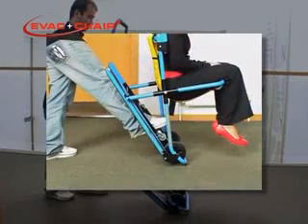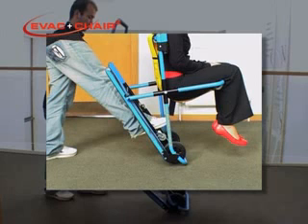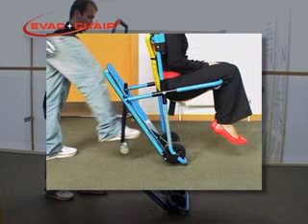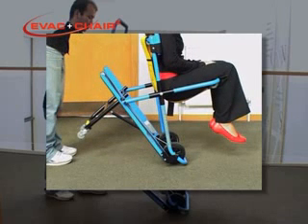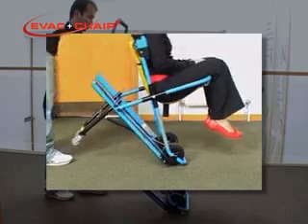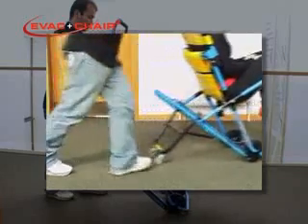Place one foot on the trolley assembly, just over the yellow sticker, and pull back sharply to unclip the trolley assembly. As you remove your foot, the trolley assembly will automatically open. You may then lower the evac chair gently onto its wheels.